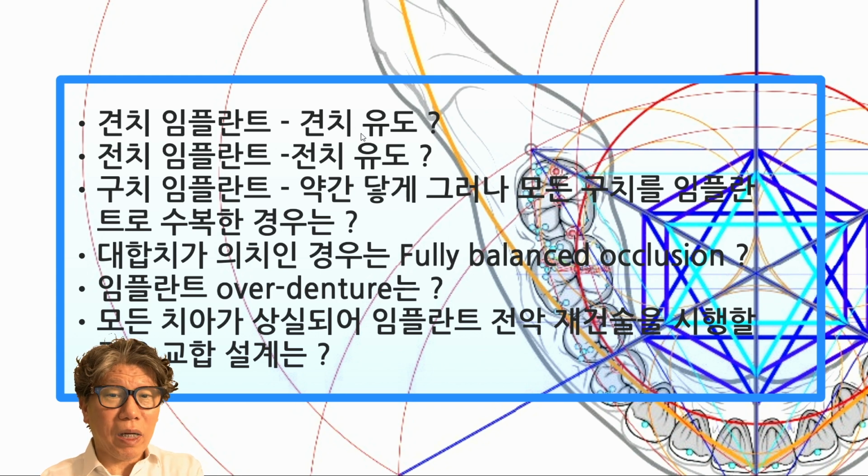Then the situation becomes one where the implant is overloaded. However, if the bone structure is healthy, it is important to use the largest possible size implant and a strong connection to create canine guidance regardless of the circumstances. This is because creating conditions that can withstand lateral pressure results in canine guidance, and if smaller implants are used, or if the robustness of the connection is lacking, meaning there is mechanical stress or poor fitting, that is, a lack of precision, then these situations arise. When canine guidance is applied, eventually issues will arise with the implant. Therefore, in such cases, methods like group function are used to align the height similar to adjacent teeth. This ensures that the canine does not only touch the canine to cause overload. However, whether that is the correct method is uncertain.